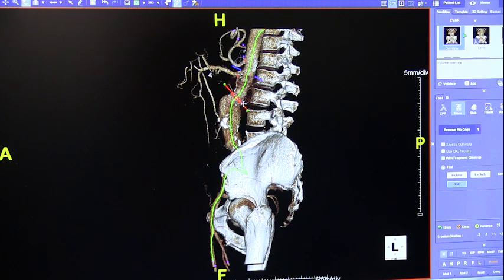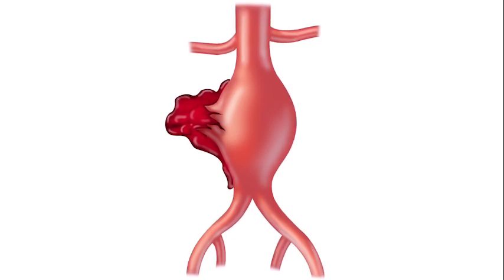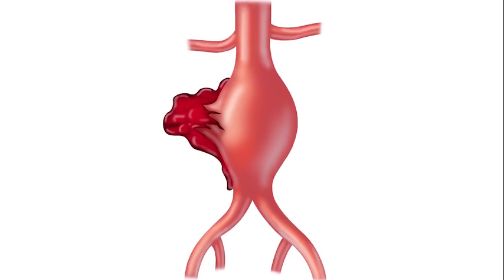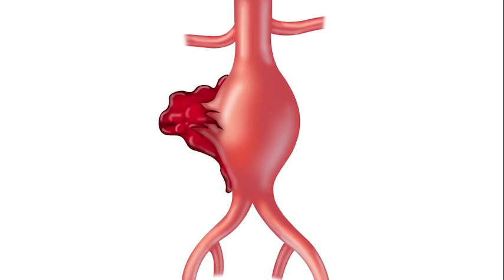Approximately 2.7 million people in the United States are estimated to have an abdominal aortic aneurysm, but only half have been diagnosed because abdominal aortic aneurysms are often asymptomatic. Abdominal aortic aneurysms are a potentially life-threatening condition, since over 85% of aneurysm ruptures lead to death. Because aneurysm rupture is so lethal, abdominal aortic aneurysms are carefully monitored so they can be treated before rupture occurs.